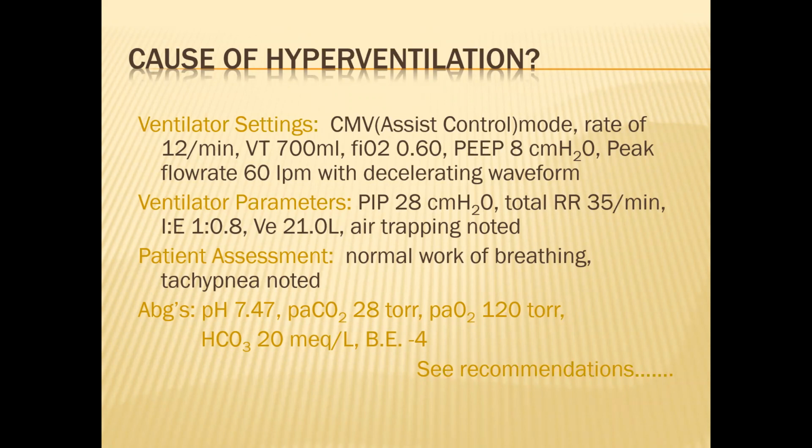Yes, okay. All right, your ventilator parameters show the peak pressure is 28 centimeters of water. Total respiratory rate, 35 breaths per minute. IE is inverse, 1 to 0.8. Minute volume, 21 liters. Air trapping is noted. The patient has a normal work of breathing. Tachypnea is noted.